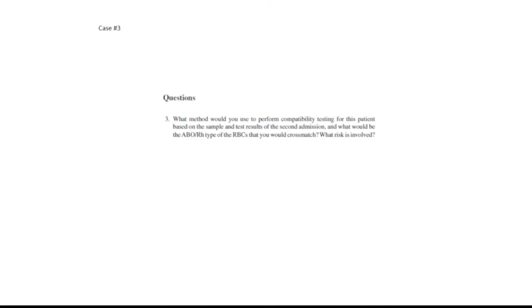Normally, that's taken to mean you should have at least 2 samples, although technically you're allowed to use the same sample, but most places won't do that, because if it's a wrong blood in tube situation, you'll still pick up the same error. So most places require at least 2 samples. It can be a current sample and a historical type, or even two current samples that were drawn separately.